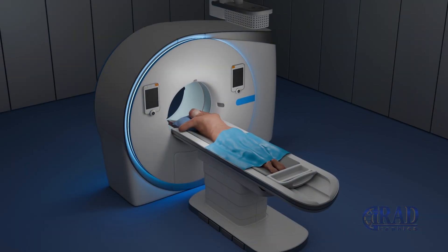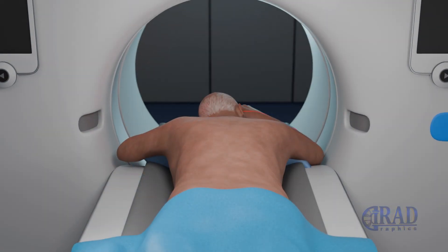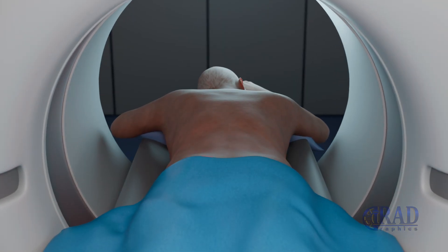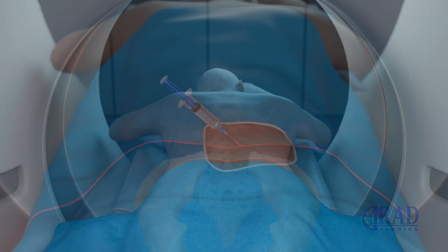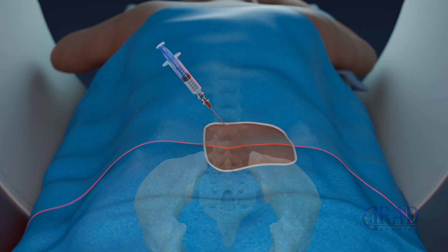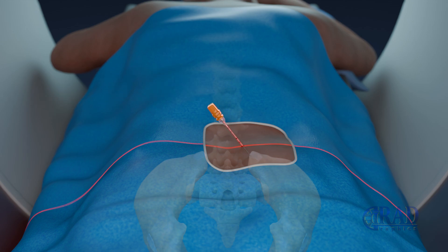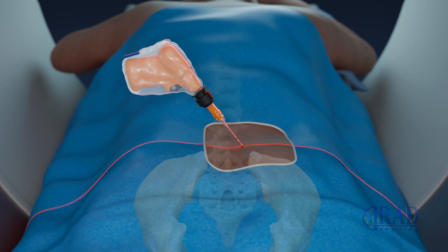CT guidance provides superior precision for deep or complex bone marrow biopsy sites. A preliminary CT scan is performed to identify the exact biopsy location and determine the safest needle trajectory. The skin and periosteum are anesthetized with local anesthesia. Based on the planned trajectory, the biopsy needle is advanced through the skin toward the bone under intermittent CT guidance.